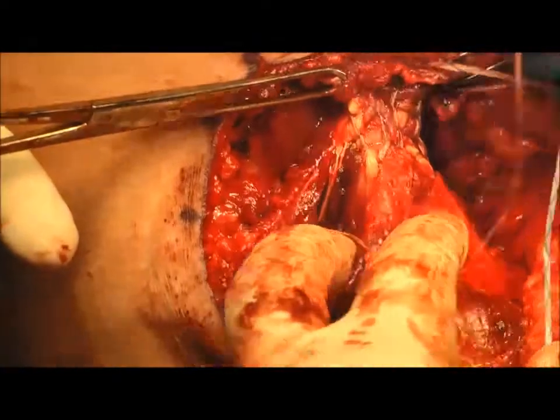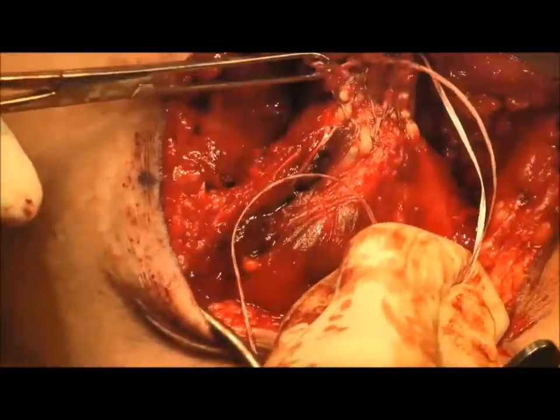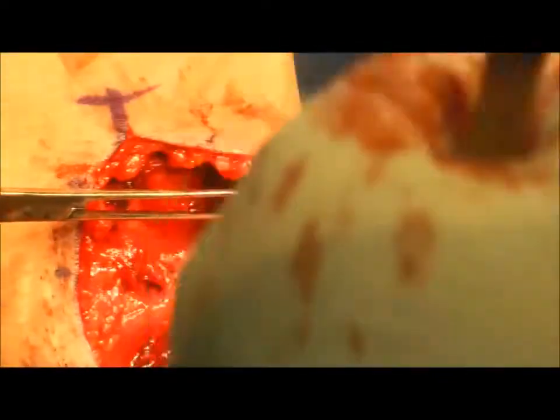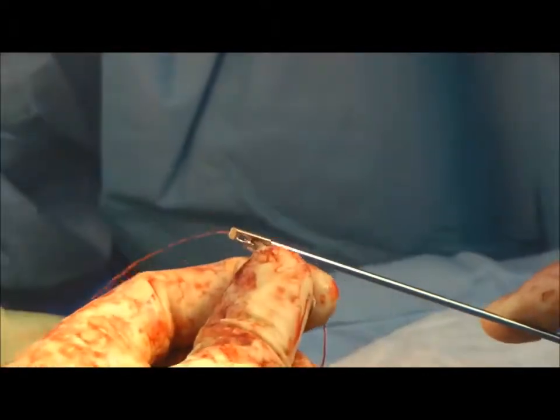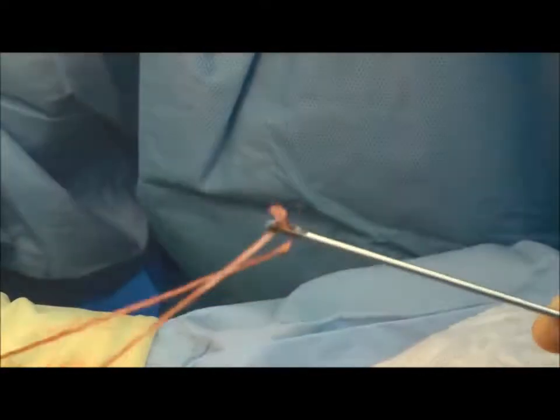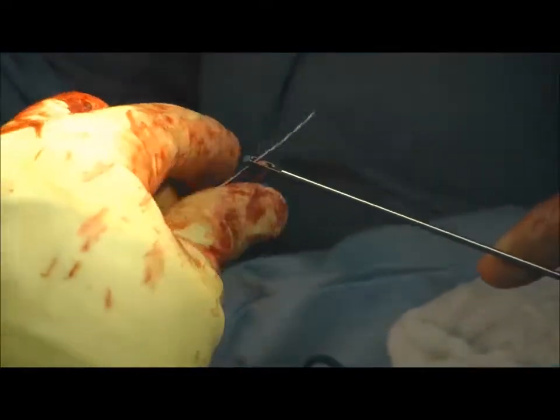The tendon is then repeatedly cycled to eliminate creep. Next, the first set of suture tape is loaded onto the button in standard fashion, with one limb entering proximally and exiting distally, and the other limb entering distally and exiting proximally, as shown.